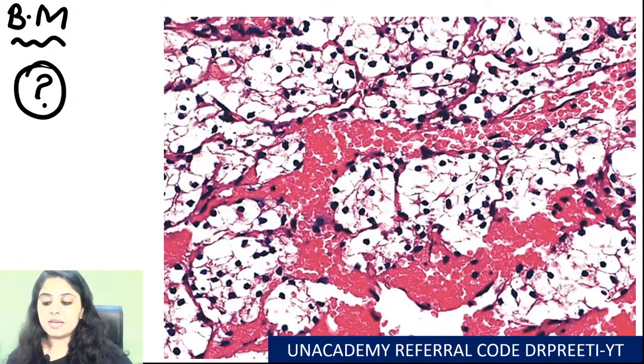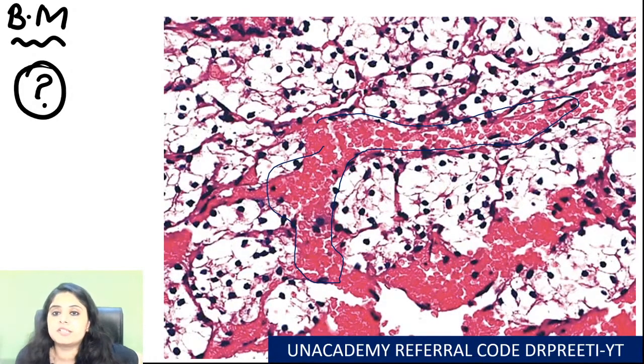Anything that comes to your mind when we look at this? It's a bone marrow and it's showing me this finding. It's showing me, yes, a lot of RBCs, blood, fine. What else? So I open it for discussion. What else do you see out here? It's a very classical finding; if I would have told you the history, then all of you will be telling me the answer within a minute.